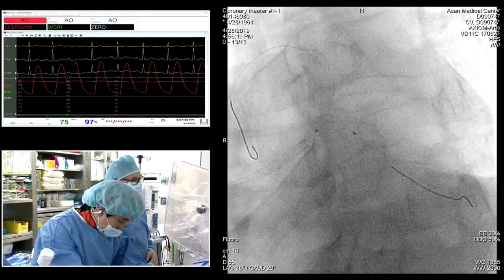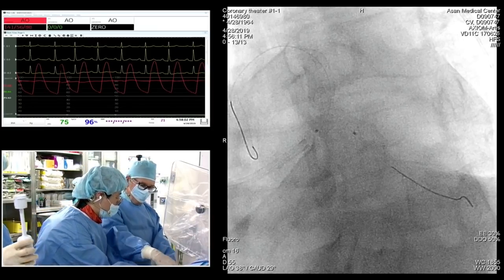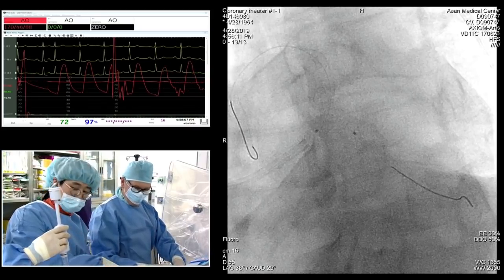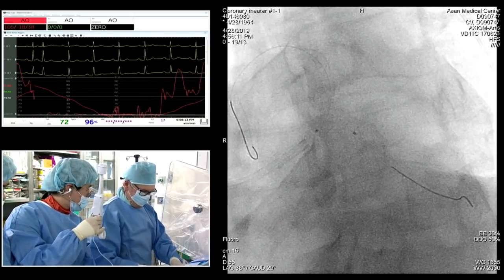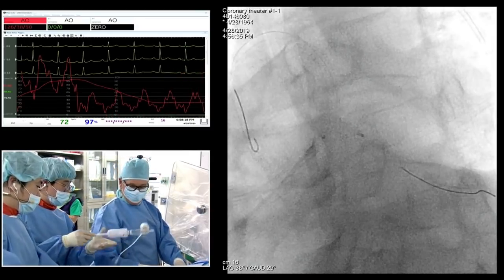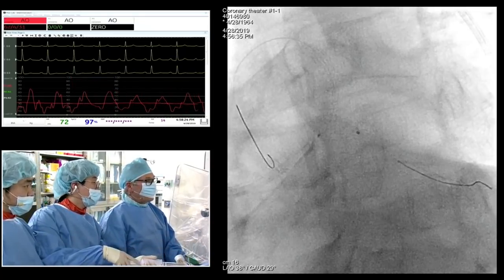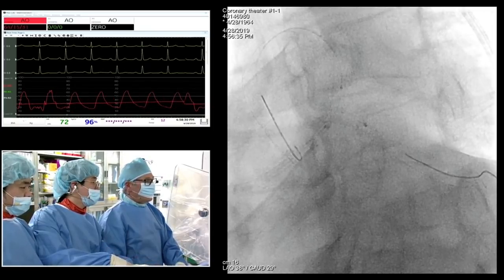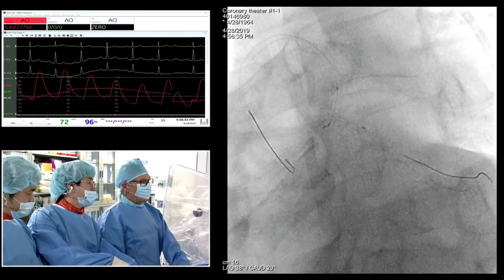You know, Thierry, I think we should do a retrospective study of all in-stent restenosis of the ostium of the circumflex and see in the long term what happened with different treatments, collecting like 200, 300 cases, big numbers. It will be a very nice study. We may learn something. I agree. Dr. Han, just before the case, told me that he's already doing that in Seoul, looking at the data. I think we can have collective data from different centers. I think it will be very interesting.